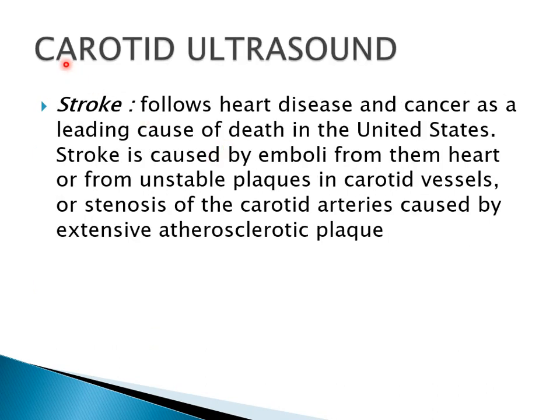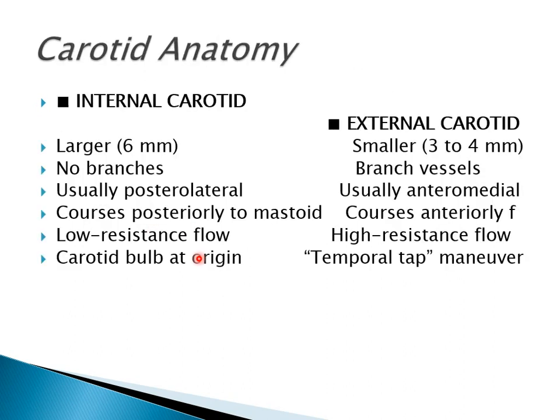We come to carotid ultrasound. Stroke follows heart disease and cancer as the leading cause of death in the United States. Stroke is caused by emboli from the heart or from unstable plaques in the carotid vessel, or stenosis of the carotid arteries caused by extensive atherosclerotic plaque.